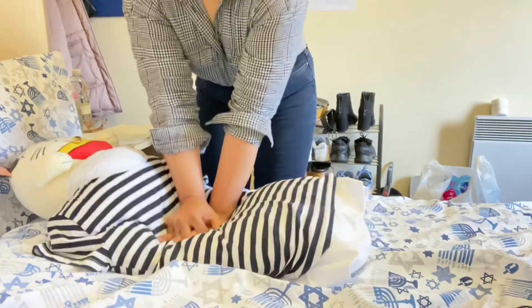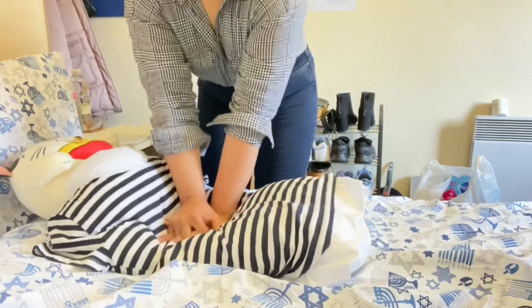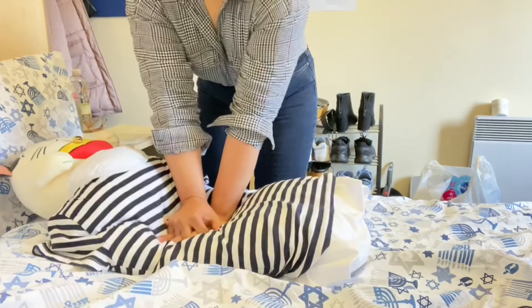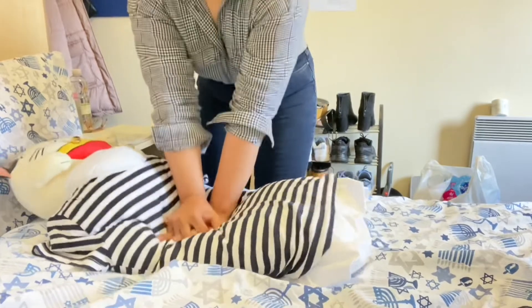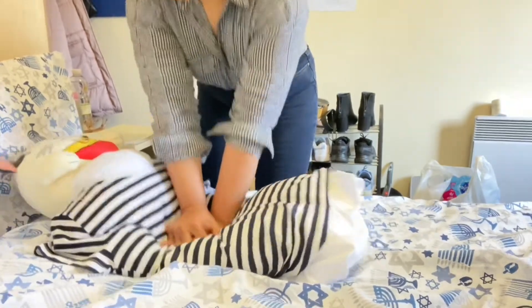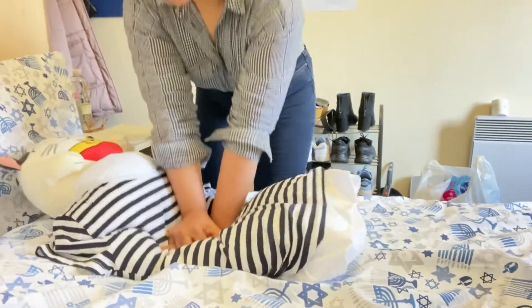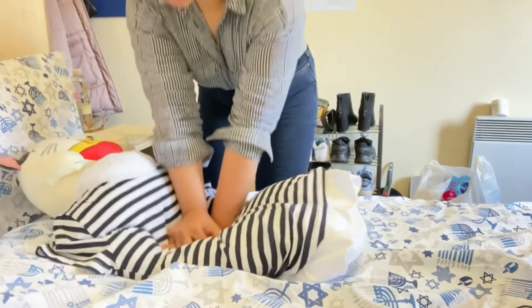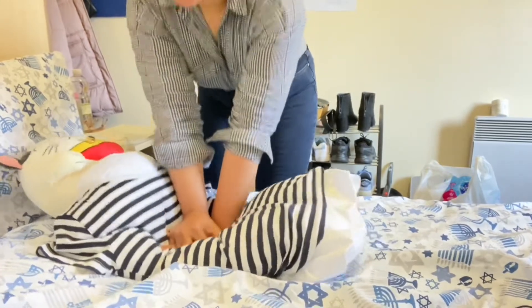My help arrives with a resus trolley. Please connect the valve mask at 15 liters and connect it to my patient, please.